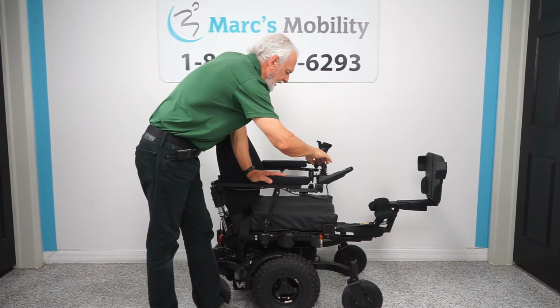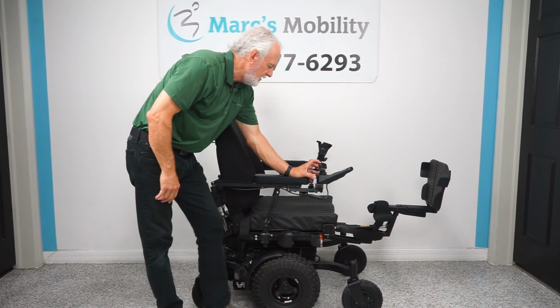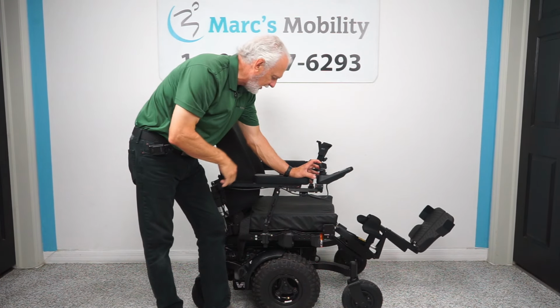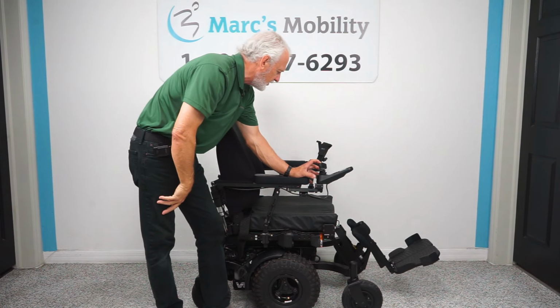Let's go to the legs and bring those down this way. Some companies, the joystick, if you go forward, it brings the legs down. Some of them you have to go back. It's hard to remember every model, every company, which way the joystick needs to be pushed. But once you have your chair, you'll figure it out really quick.